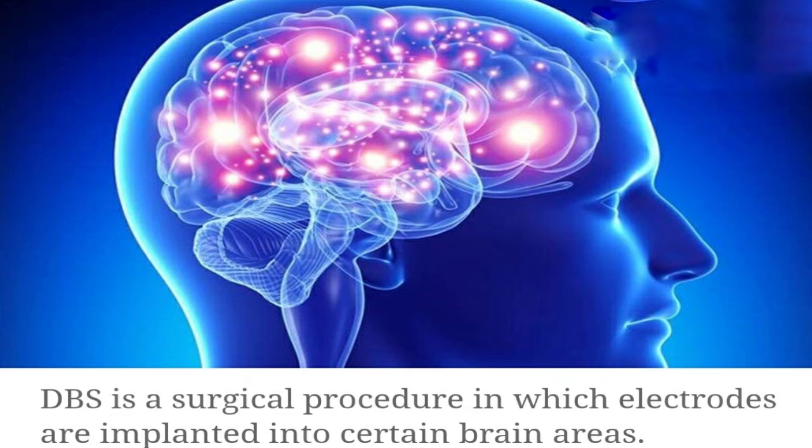The physicians have tried to reset these patterns, which they have said is the equivalent of using a pacemaker for the heart. The work, which represents a landmark in the use of neuroscience to treat psychiatric disorders, has been published in the journal Nature Medicine. The doctors used an existing technique called deep brain stimulation, customizing it for the patient's case.